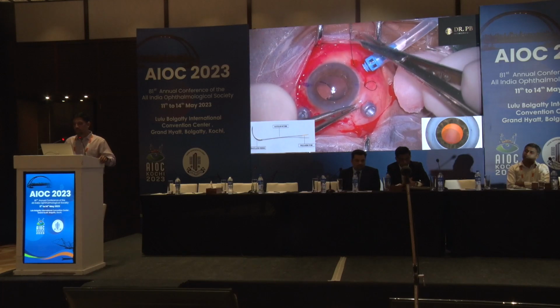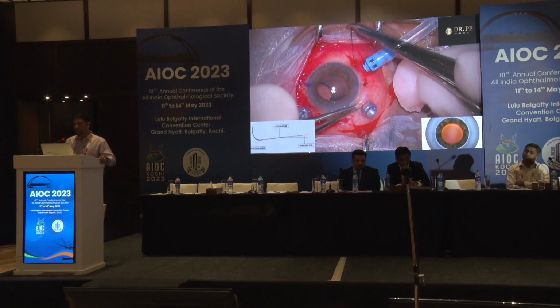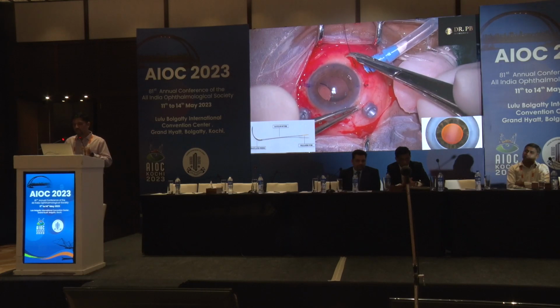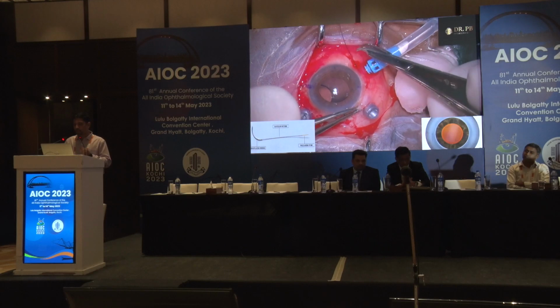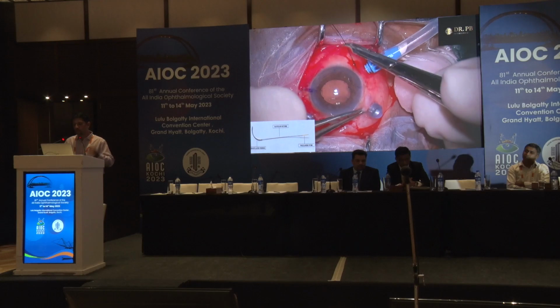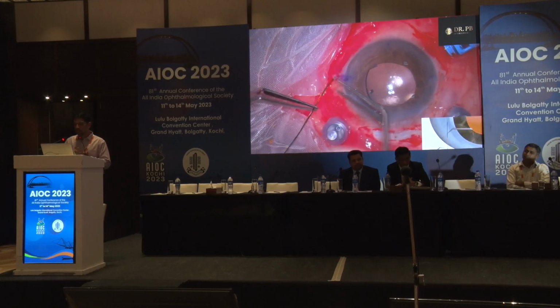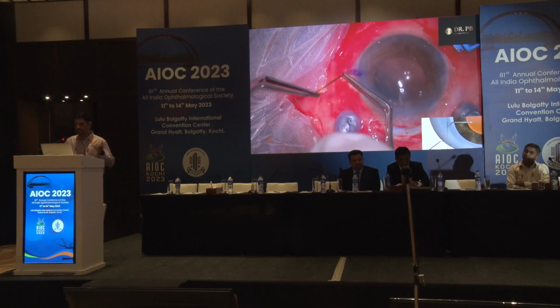So keep pulling gently the nylon suture. You can see the suture is attached to the polyamide tube. This is what we have done in SFix. That's a USP of this device. And as you pull, the haptic will just follow and get fixed into the suture track that you have formed.